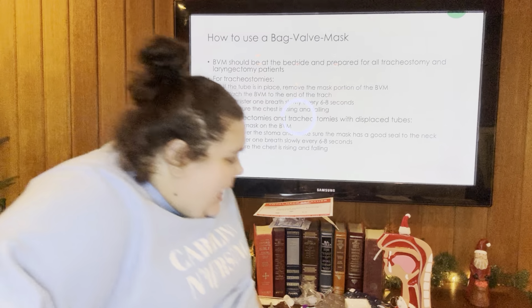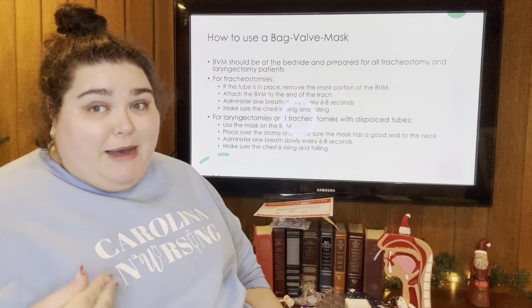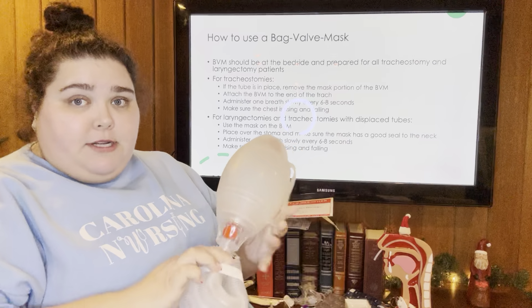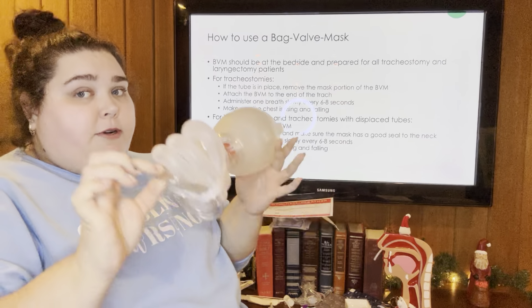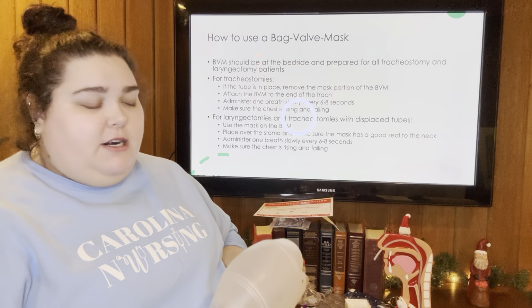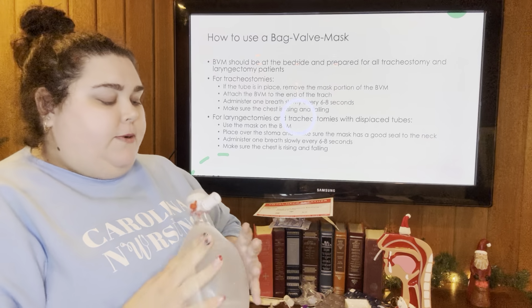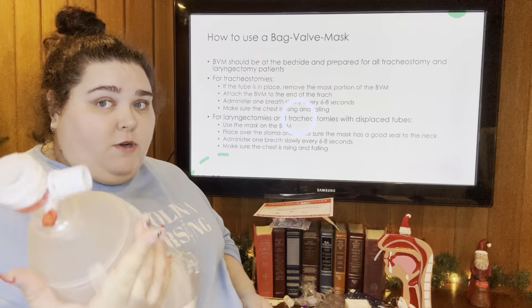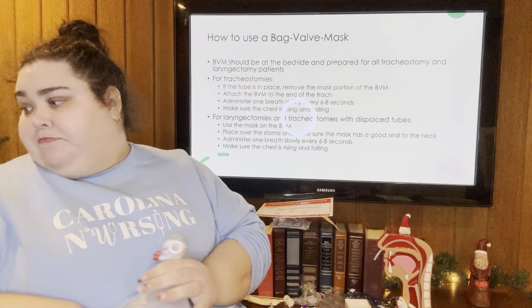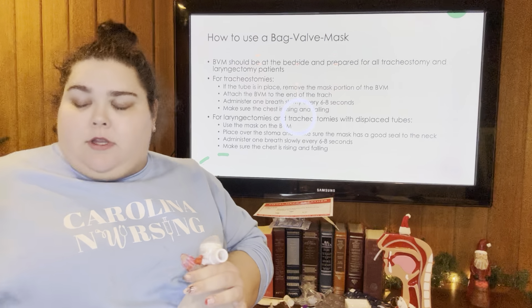So our last section here, we're going to talk about using the bag valve mask or the ambu bag. So that is this sucker. In the hospital, we can hook this up to the oxygen in the wall, and we should do that whenever we're in the hospital. In the home setting, we don't always have oxygen to hook up to, so that's okay. This comes one of 2 ways. In this situation, it is the trach adapter. It also has a mask adapter.